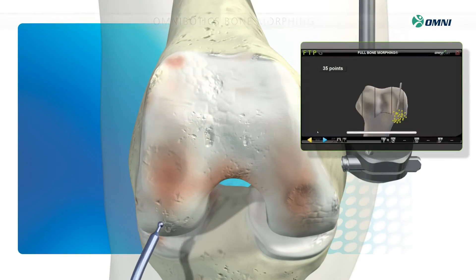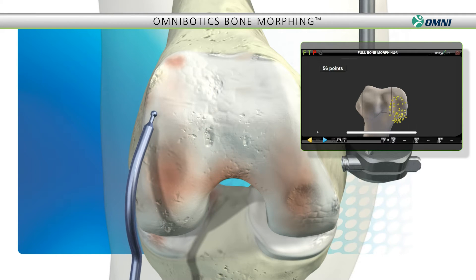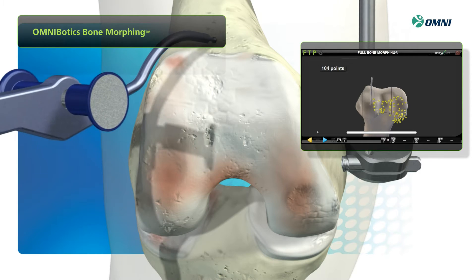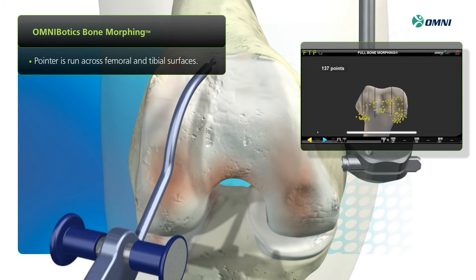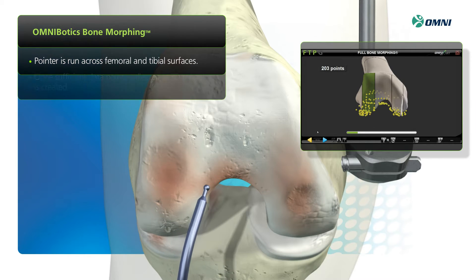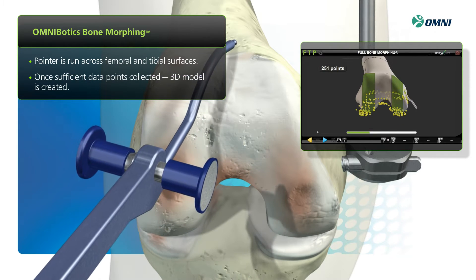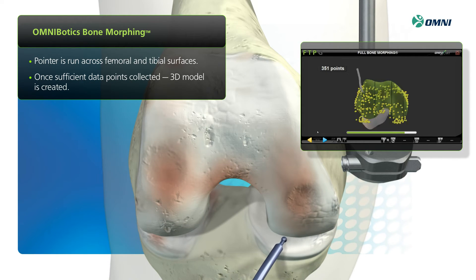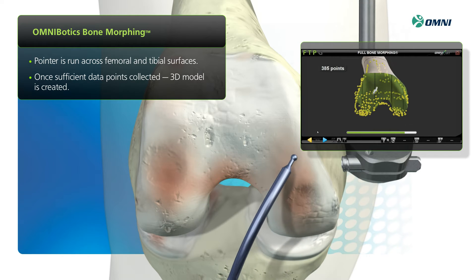How does the system optimize implant fit? It includes patented bone morphing technology, which allows you to quickly create a detailed, accurate 3D digital model of the knee. Bone morphing is intuitive to use — simply run the pointer across the femoral surface as shown. The system allows you to rapidly acquire data points and alerts you if more points are needed.